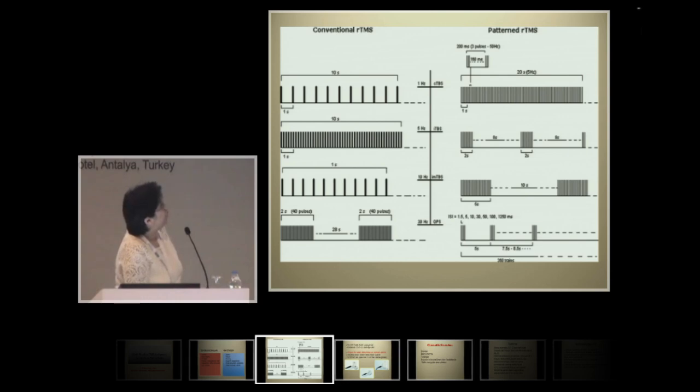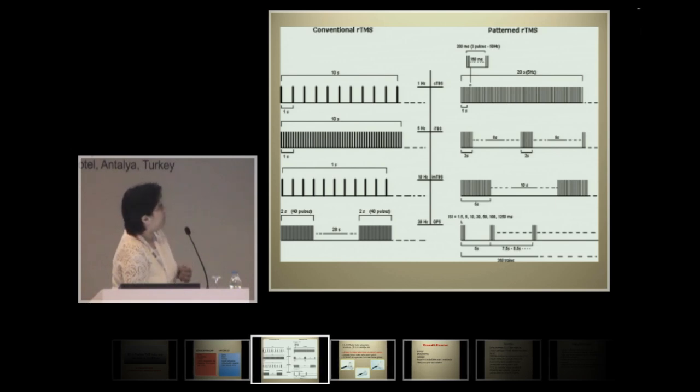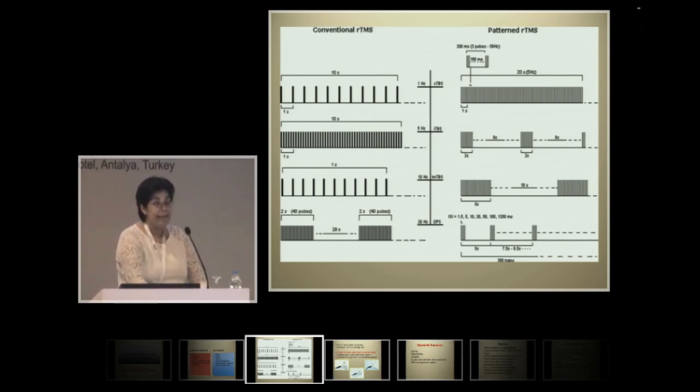Although we don't apply it ourselves, we hear from the literature there's something called continuous theta burst stimulation or intermittent theta burst stimulation. This is where the frequency is very high, like 50 Hertz. However, in 1 second, not 50 pulses are delivered in a row, so only 3 pulses are delivered, but at a frequency of 50 Hertz, or there's something we call quadripulse. So only 4 pulses are delivered, and there is a break, there is a waiting time until the next pulse.